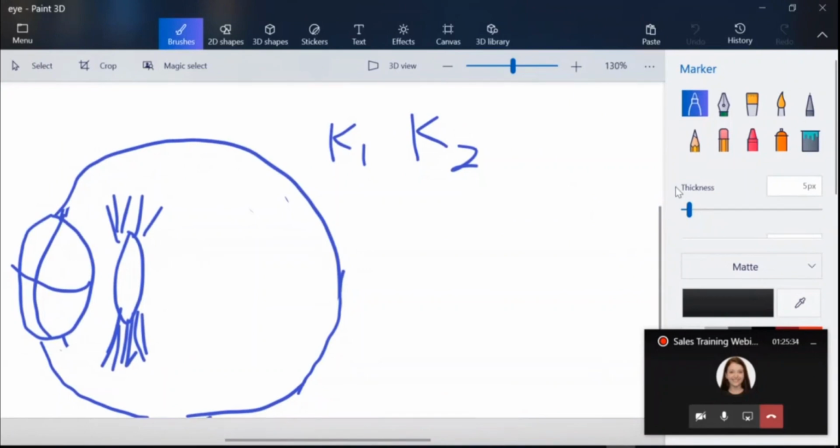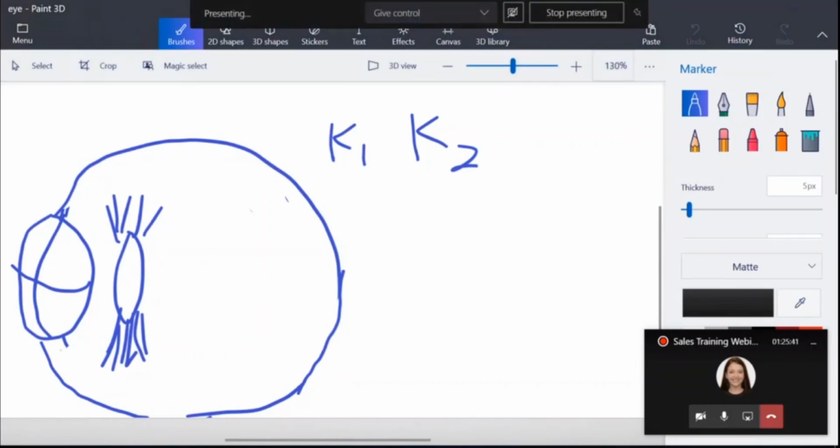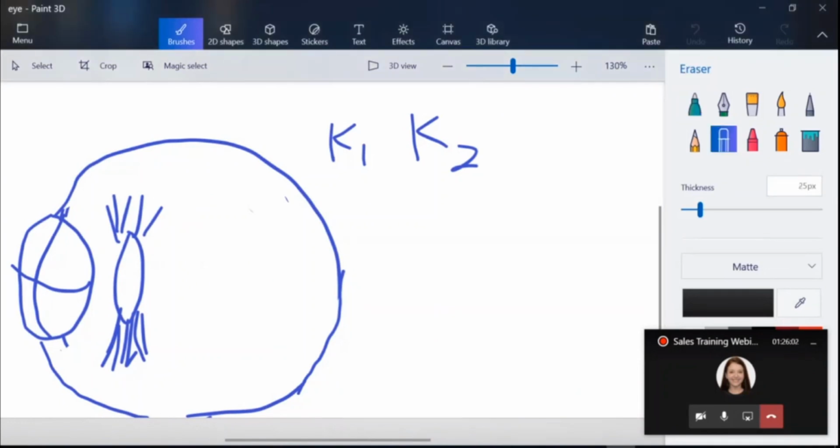Okay, so are you seeing my drawing here? Not that great a drawing, but I hope you understand what I'm trying to represent here. So you see this is what is represented with an eye that is untouched, with the natural lens, right? So when this cataract surgery is performed, the lens is taken out. So you don't have any more lens in there.